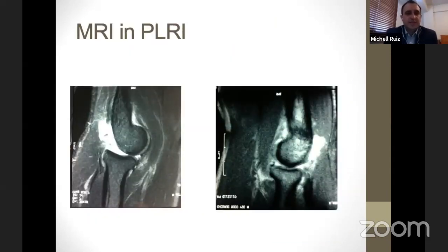The patients with posterolateral instability of the elbow will have very specific findings in the MRI. We know that the elbow in this kind of instability is going to be unstable with the elbow in full extension and supination of the forearm. That is the position that the patient has to keep during an MRI exam. Most of the patients that go through an MRI for this pathology are not going to be able to go through the MRI because it's going to be very painful and very uncomfortable. And this is the reason.